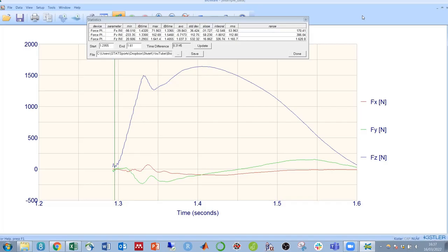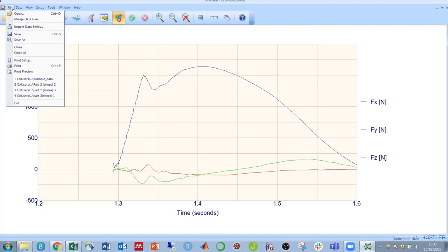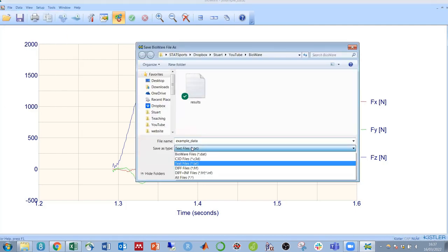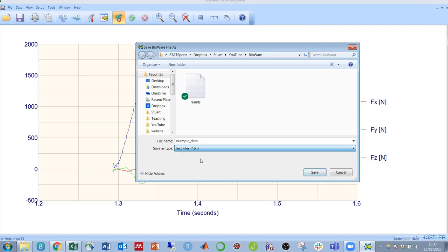Likewise, if you want to export all of the raw force data into Excel in order to calculate something manually or to import it into another program, you can do so by simply clicking file, save as, and then saving as a text file.